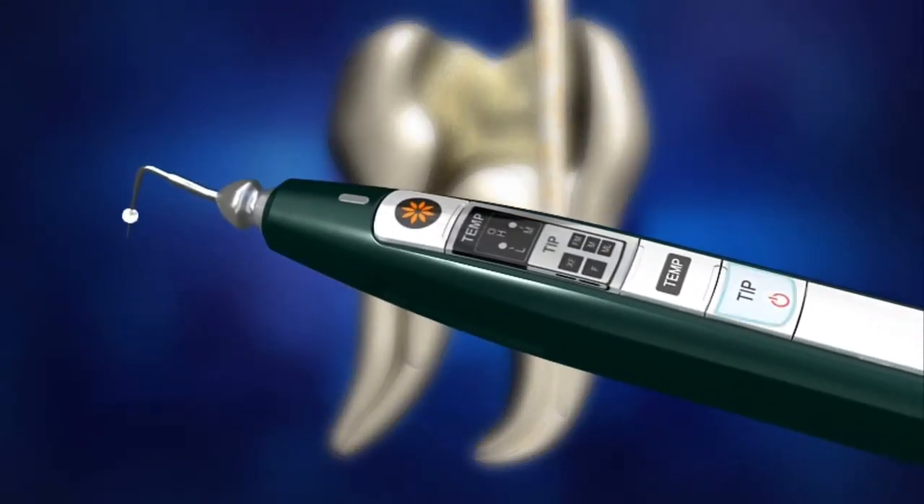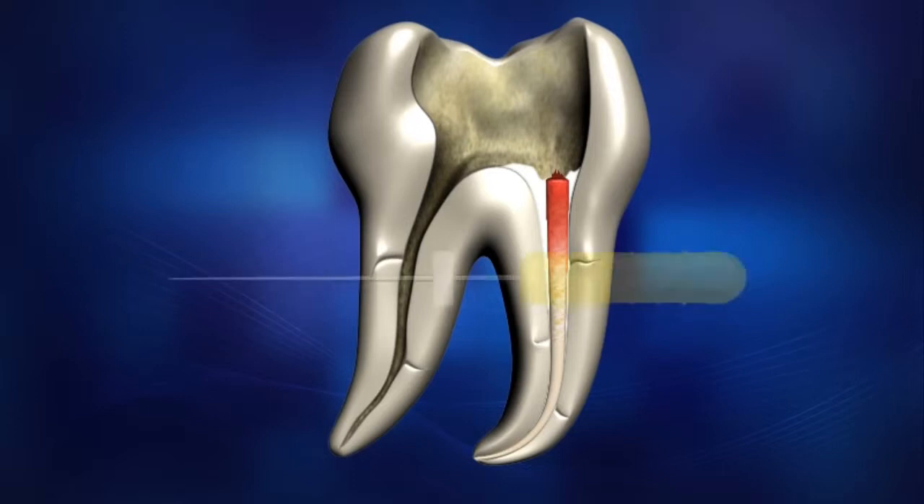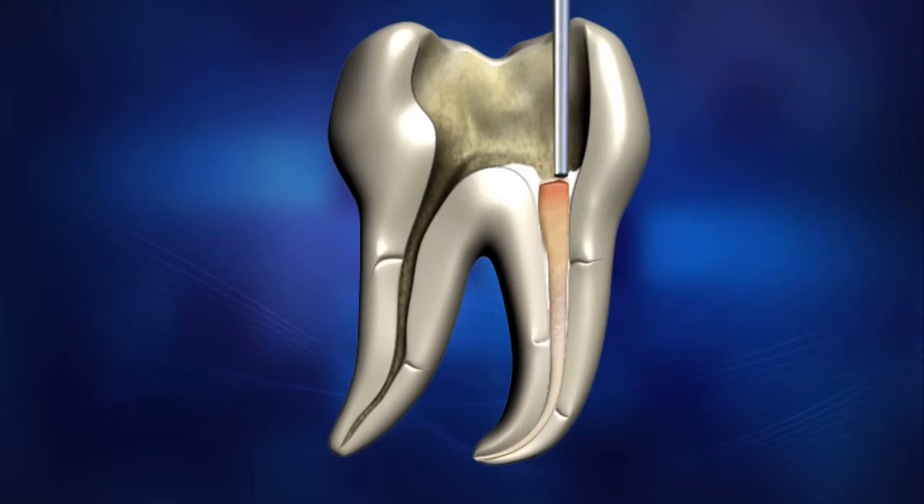Turn on Diapen by pressing the power button. Place the pen tip in the orifice of the canal and activate Diapen by pressing the operation button. Using the activated pen tip, cut the Gutta-Percha cone. It takes less than 1 second to reach the set temperature once the operation button is pressed. Be careful not to come in direct contact with the tip, which may be extremely hot. After cutting the master cone, use the selected hand plugger to condense the softened material.